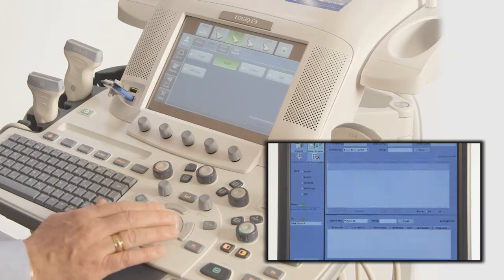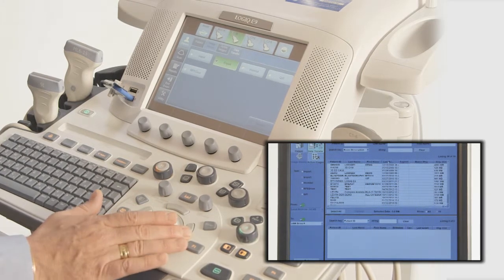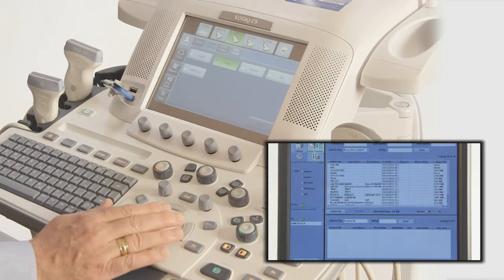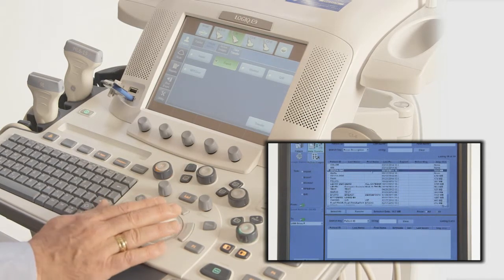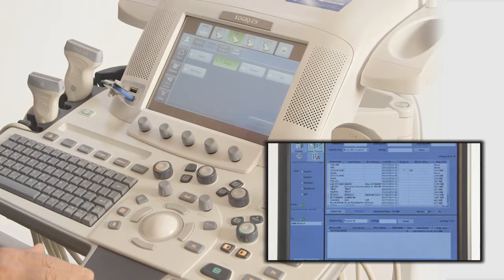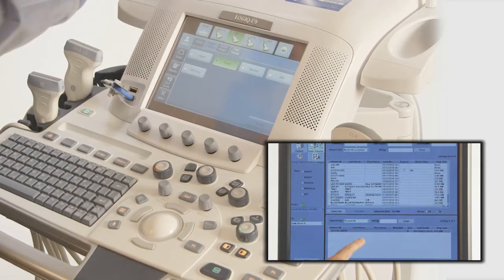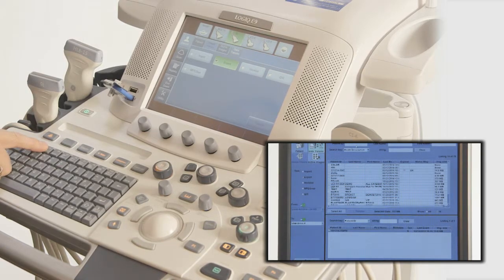The list of patients can be ordered chronologically by clicking on the Last Exam column header. Choose the patient or patients you wish to export and then press Transfer. Once the transfer is finished, the media will need to be ejected using the F3 key.